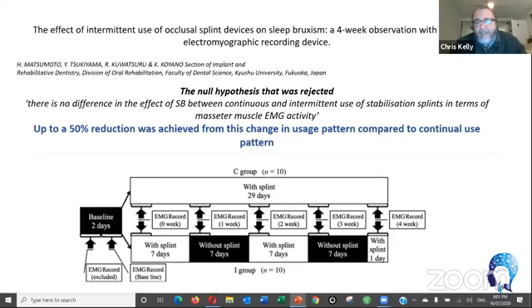And if they do that, the fulcrum is different. It's not as comfortable for the patient. You'll get a lot more complaints. What I've found over the years is that by changing the pivotal contact to be mid splint, just like we do in dentures, you're going to get a better spread of load on the jaws.